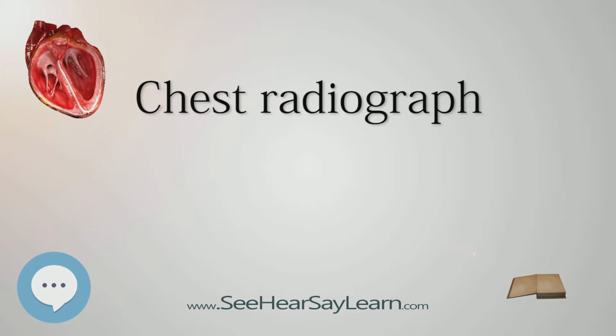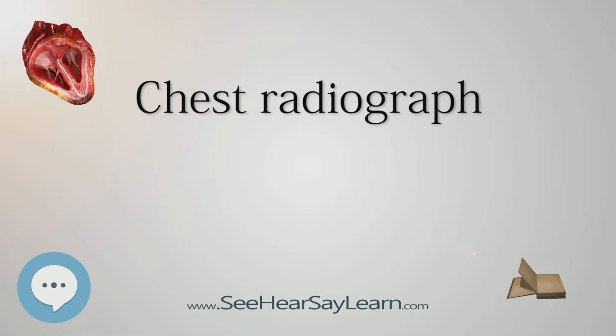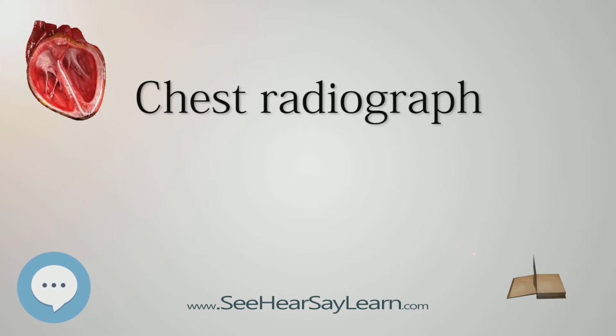Diffuse shadowing. The differential for diffuse shadowing is very broad and can defeat even the most experienced radiologist. It is seldom possible to reach a diagnosis on the basis of the chest radiograph alone. High-resolution CT of the chest is usually required and sometimes a lung biopsy. The following features should be noted.